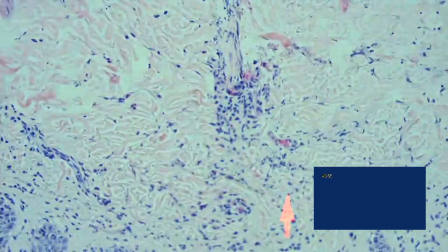Now, usually that's superficial and deep. And because it usually occurs over and over again at the same site, you'll often get melanophages that occur relatively deep here. Here's a little bit of a slightly deeper infiltrate here. It's subtle. But unfortunately, our examples of these diseases don't always read the textbooks, so this one didn't give us a deep infiltrate, didn't give us the deep melanophages. So, again, we're looking at an interface dermatitis with mixed infiltrate, the eosinophils and dyskeratotic keratinocytes. So this is a nice example of fixed drug eruption.